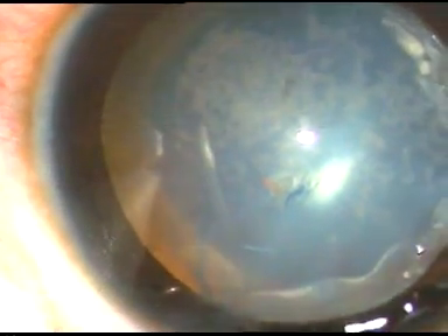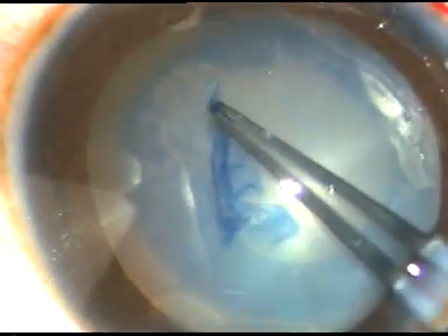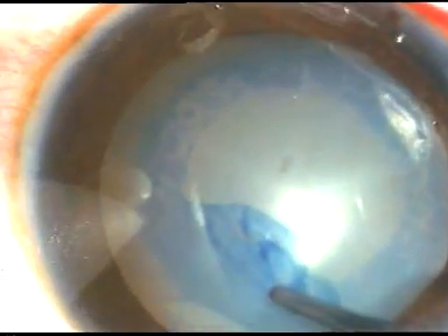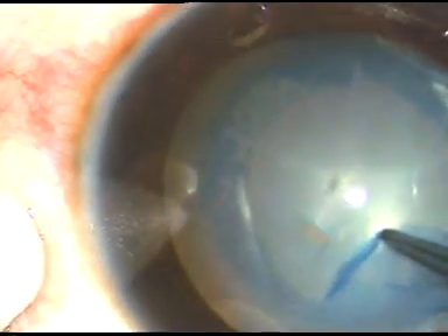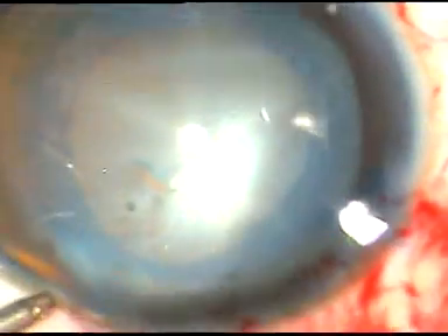I want to place a lens in the sulcus with optic capture. I have raised a capsular tag and hold this tag with the Utrata forceps. I go anti-clockwise, frequently re-grasping — release and re-grasp — and I make the rhexis. This is an adequate-sized rhexis, and I hope optic capture will be possible.